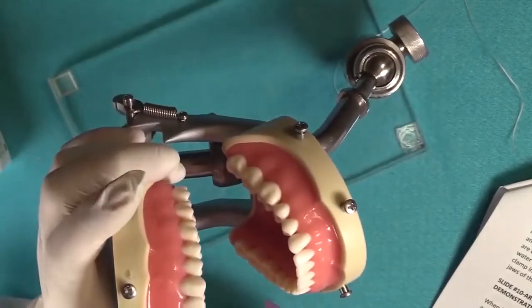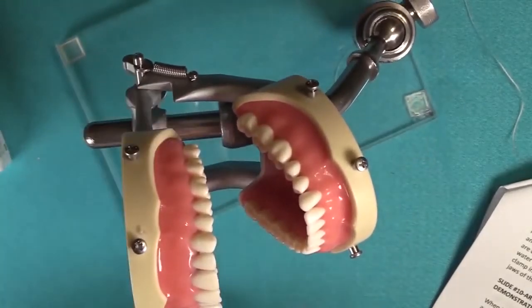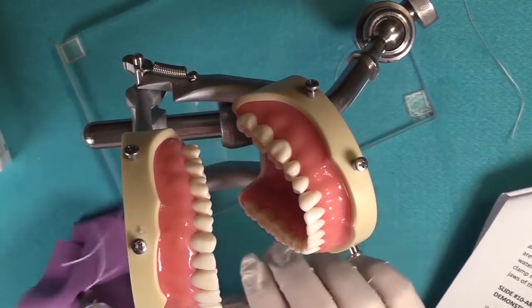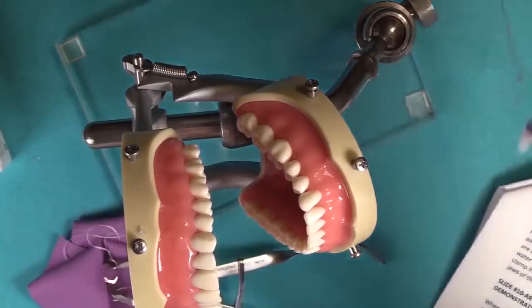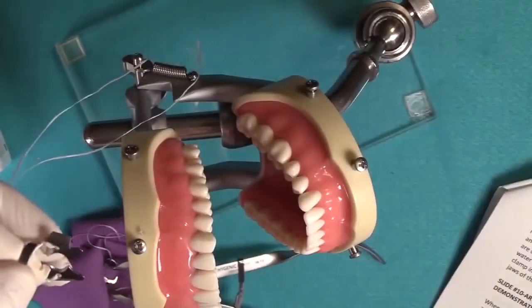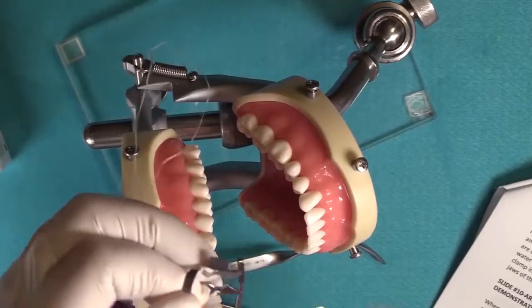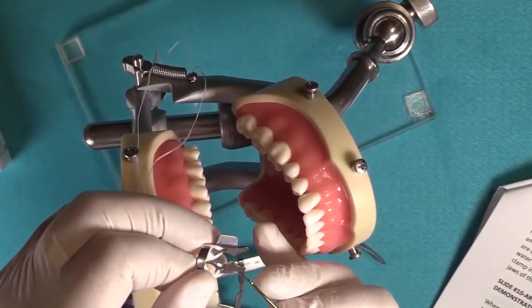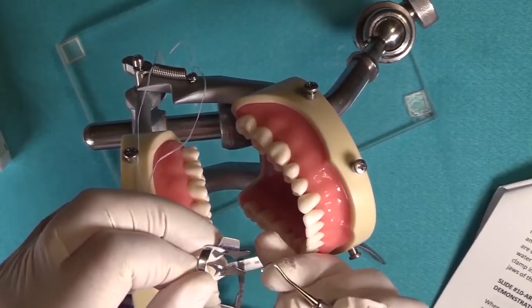A wingless clamp like this is generally what we recommend for folks when they're doing a class 2 and using a sectional matrix system, as there's less clamp to interfere with the separator ring. On the winged clamp, the part that interferes is this projection right here. Now, some clamps have a smaller projection, and that's okay.